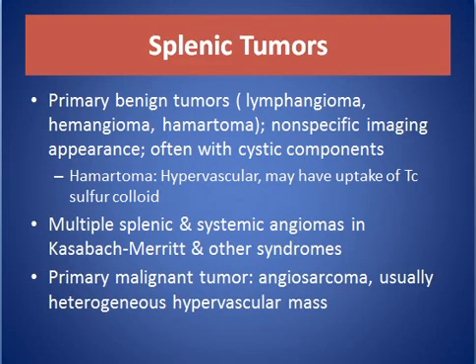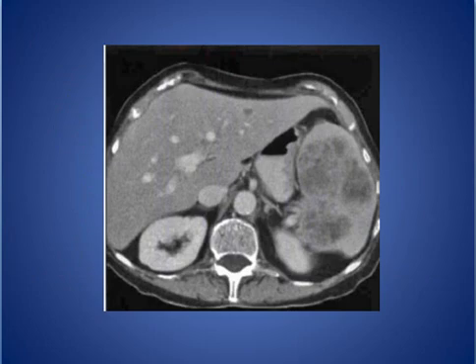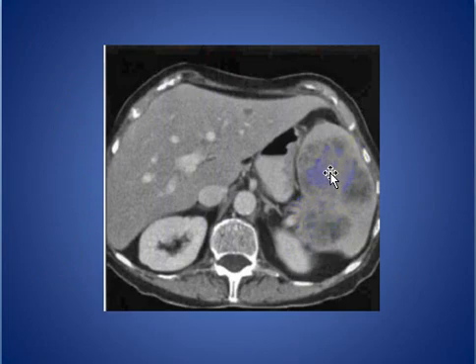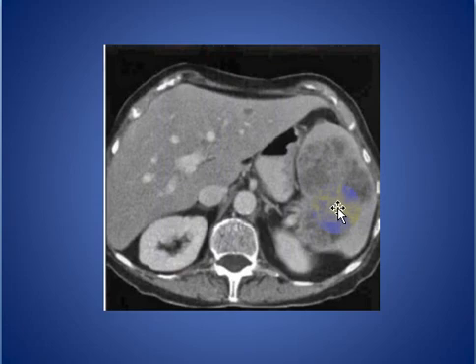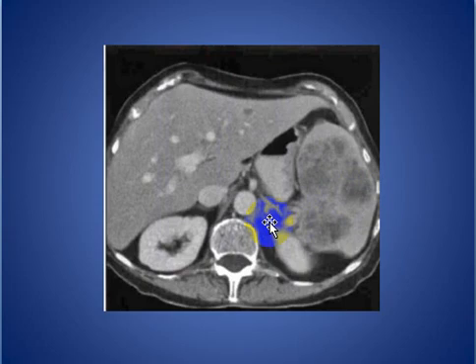Primary malignant splenic tumor — angiosarcoma — is usually a heterogeneous and hypervascular mass. As seen here on axial CT, a heterogeneous splenic mass in a 72-year-old woman with left upper quadrant pain; a benign endothelial tumor was found on resection, though the imaging appearance is non-specific.